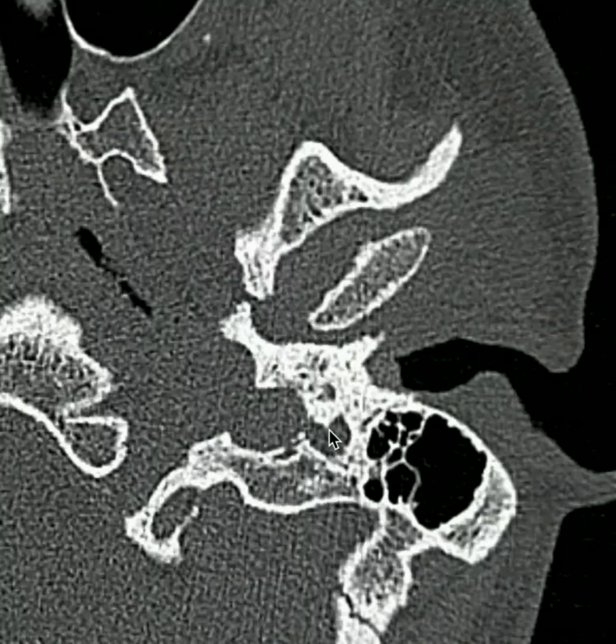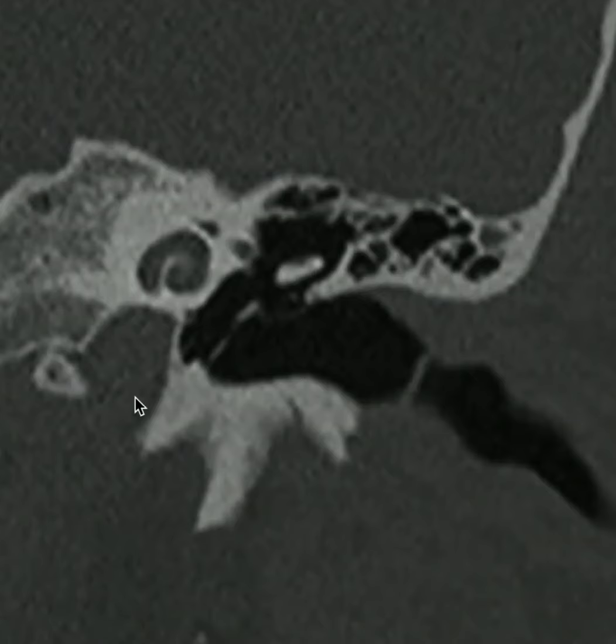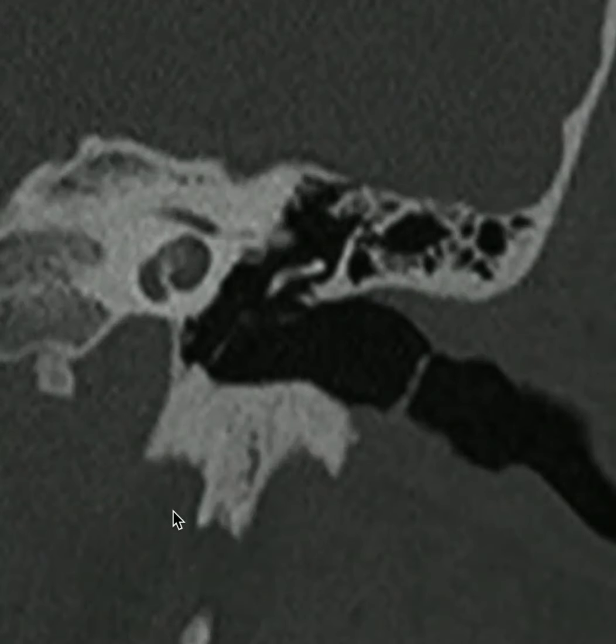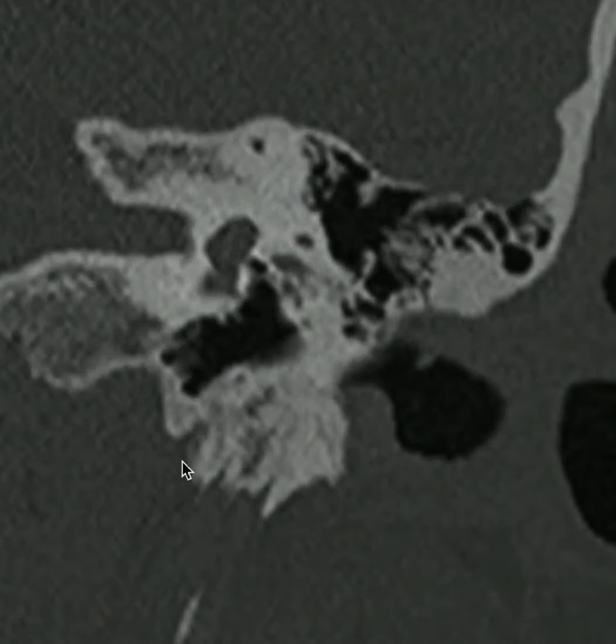At the skull base, we should also pay close attention to the carotid canal and the jugular fossa, and we will now discuss additional nervous structures which course through the temporal bone. Here is the carotid canal. Down below is the jugular bulb. As I scroll posteriorly, I'm going to notice an opening in the jugular bulb right here.